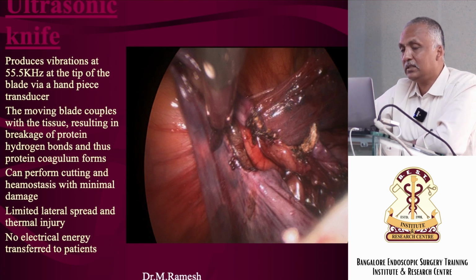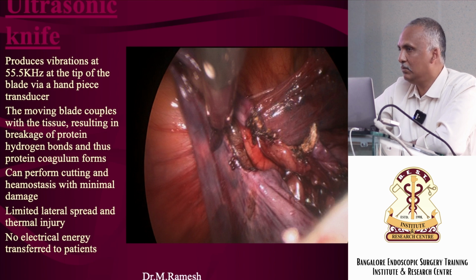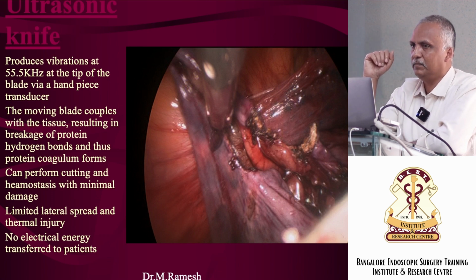So harmonic scalpel is a very dangerous instrument. It's a very good instrument, but at the same time it's hot. You have a hot instrument in your hand, please remember it. Whatever you touch, you have to be very careful. In bipolar, monopolar, you can touch anything as long as you are not pressing the foot switch.